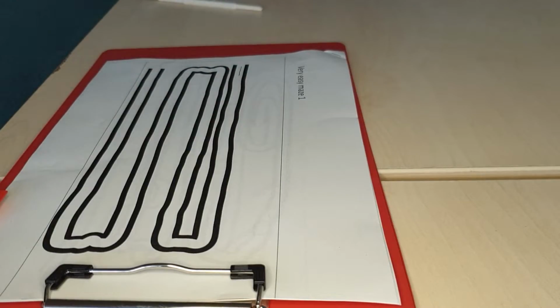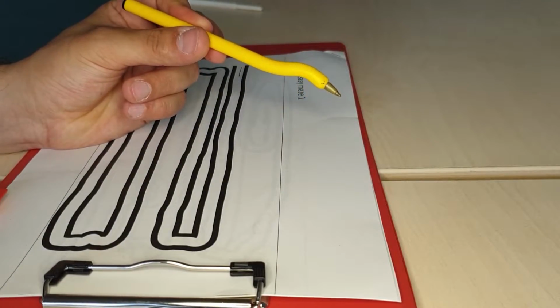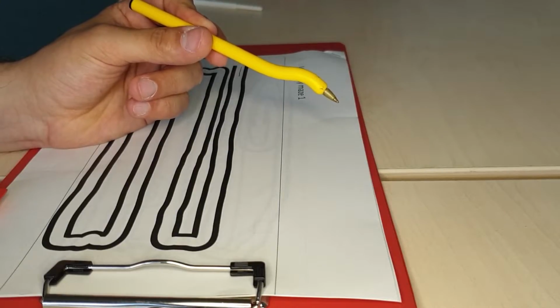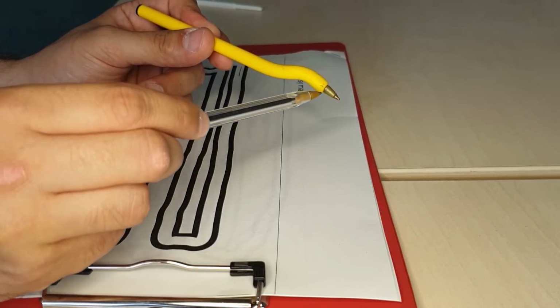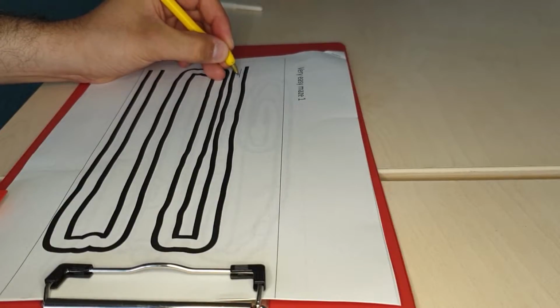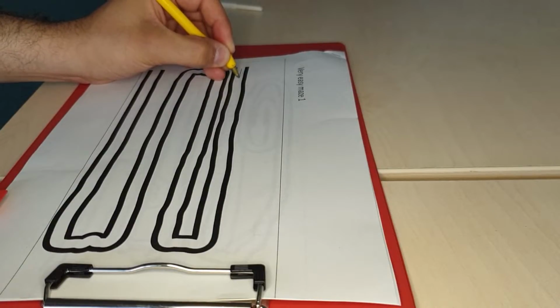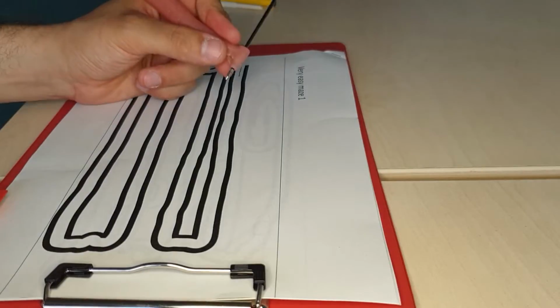We looked at different products that were available on the market. One of the things that we considered were pens designed to improve handwriting. One of the market potentials we found was this, which has a slight angulation. But the issue with this is that it's not 90 degrees to the long axis. So although it would, in some ways, provide us with a little bit better simulation of the handpiece, it still wasn't perfect. And that's how we came up with the idea of making this pen.